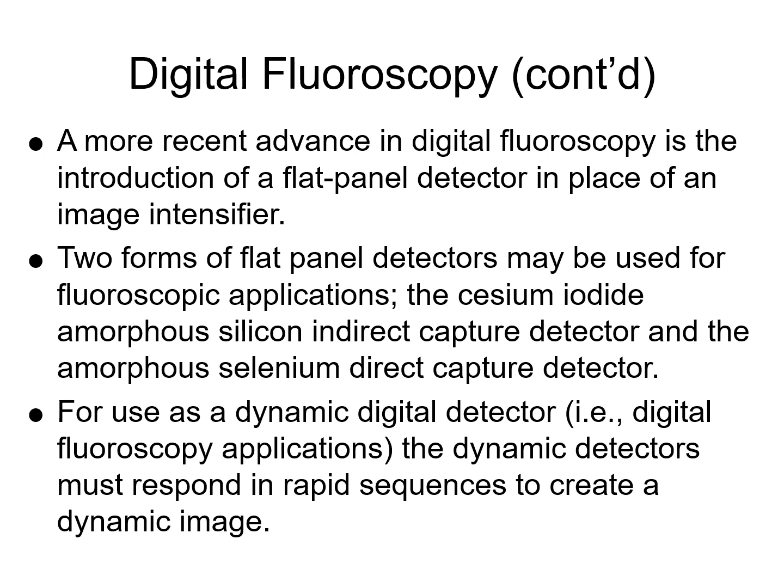Okay, and then we segment it a little bit better than a CCD does, and we provide individual data dump lines rather than bucket brigade technology. And so we improve the way that we basically unload the digital detector in third generation DR plates.